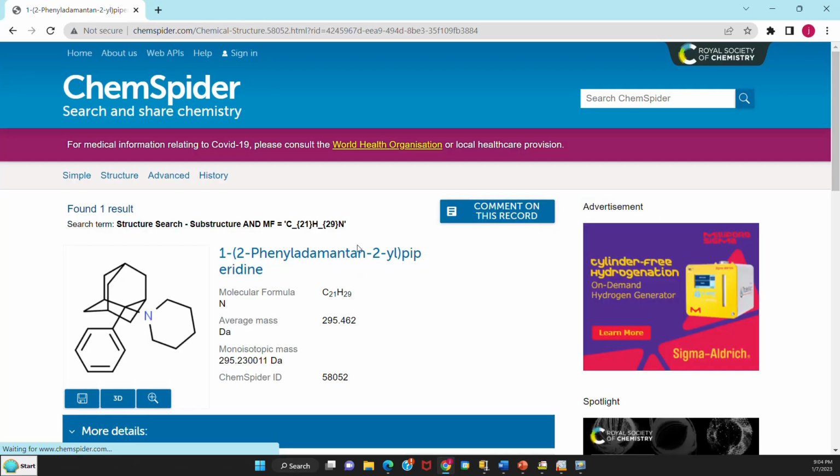Now the results have come back, and you can see we only found one result that was consistent with it, and it was the structure for the compound. So we got that directly without having to do any of the complicated chemistry, figuring out which ketones might have reacted to do it. So that worked fairly well.